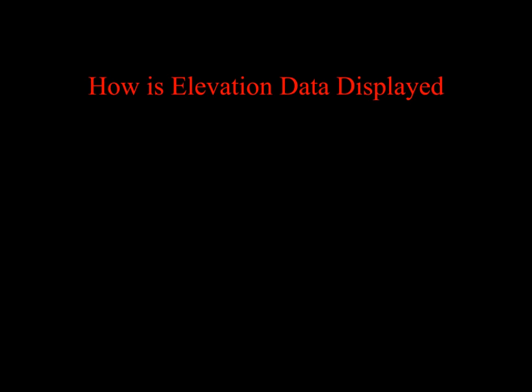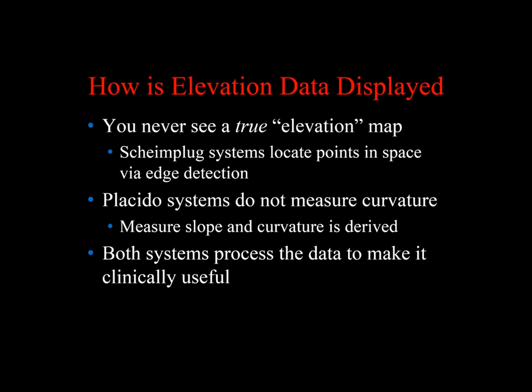So I started talking about elevation without really describing how we actually display the elevation. We use the term elevation actually incorrectly. You never really see a true elevation map. The Scheimpflug system, just remember the picture I showed you with the edge detection, locates points in space via edge detection.